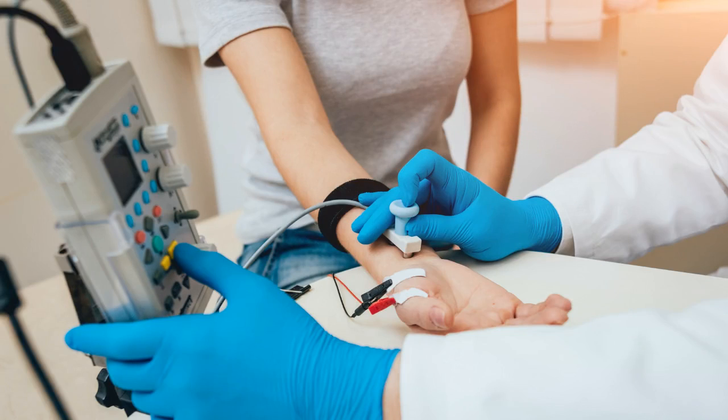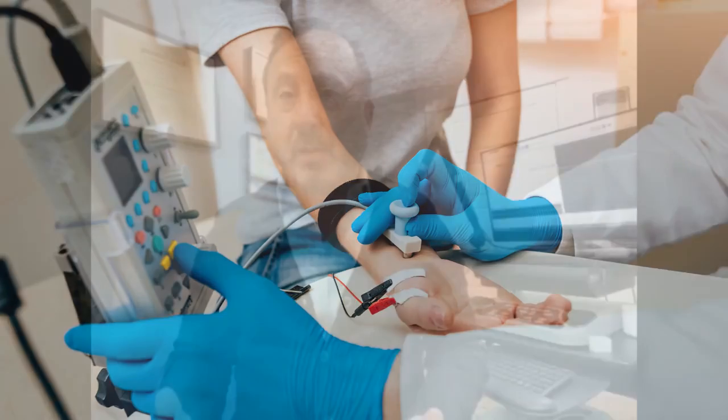And it's also important to understand that if you, for example, have weakness or numbness or imbalance, just because you have those symptoms, unless those symptoms are caused by a peripheral nervous system problem, a nerve conduction test and EMG test is not going to tell you anything about why you have weakness. So we have to have it either related to nerve roots, the plexus, the peripheral nerve, the neuromuscular junction, or muscle itself. And that's where nerve conduction studies or EMGs come in.